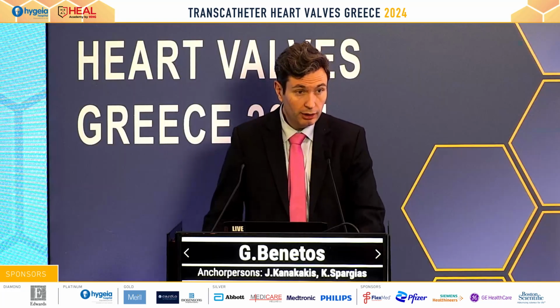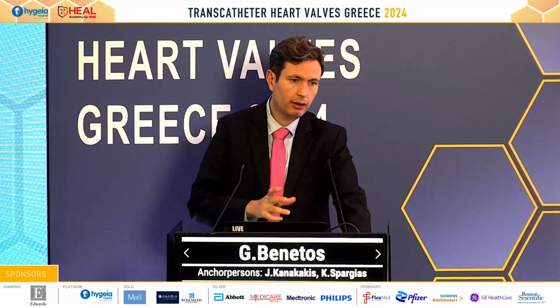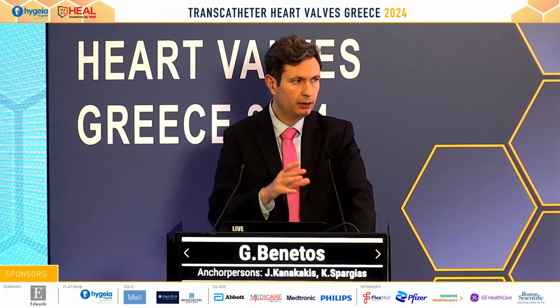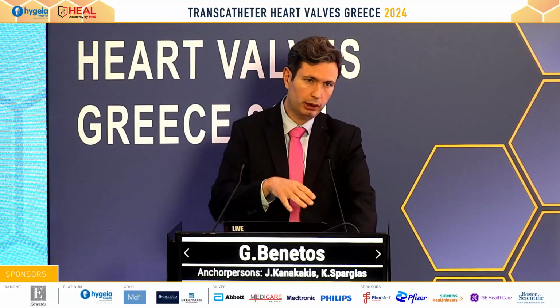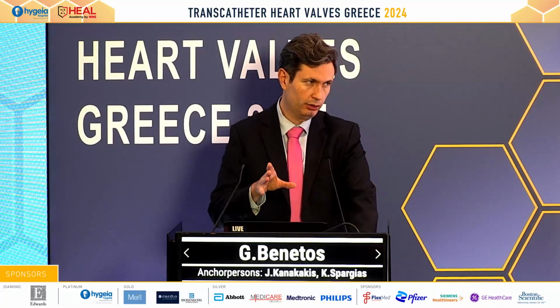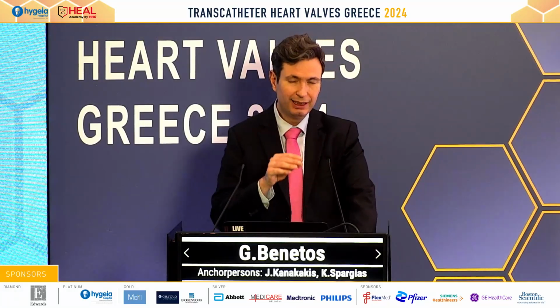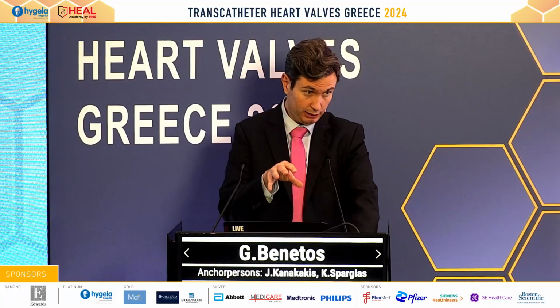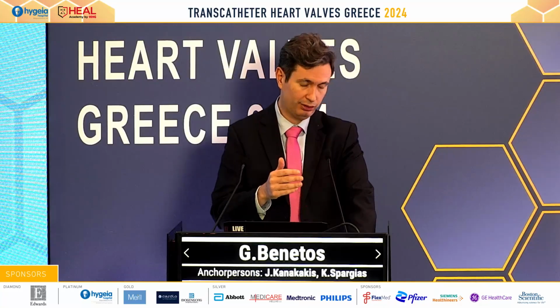Great questions both. Regarding the first question, if there are differences in measurements between 2 readers, then most of the times it has to do with them defining a different plane, and not because the one uses polygon or the other uses freehand contour. So if you have exactly the same plane in both readers, then whatever method you use, it's going to give similar results.